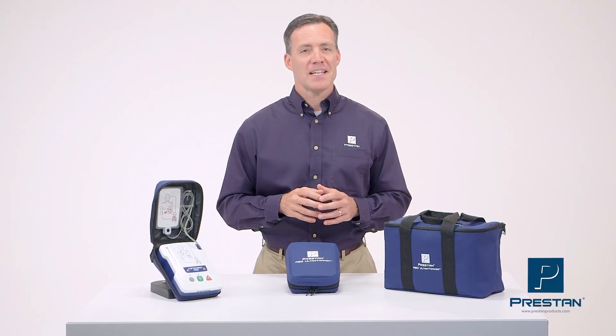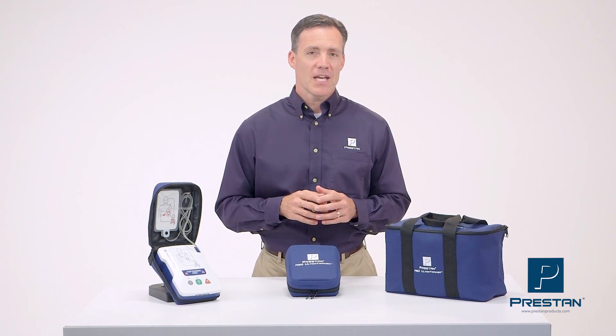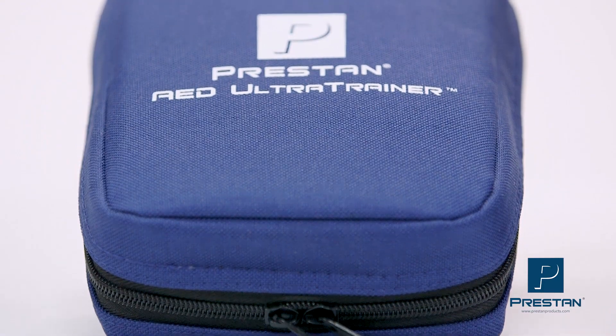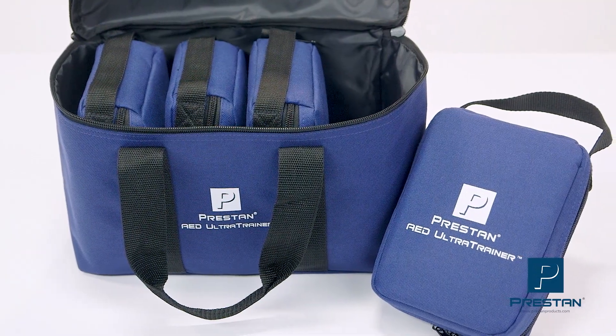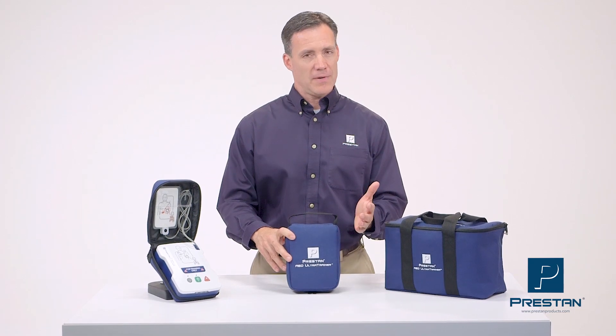The Preston AED Ultra Trainer is reliable, affordable, and will provide your students with a quality training experience. It is available as a single unit or convenient 4-pack. Contact your Preston authorized distributor for more information today.